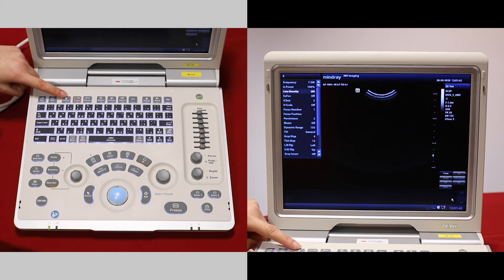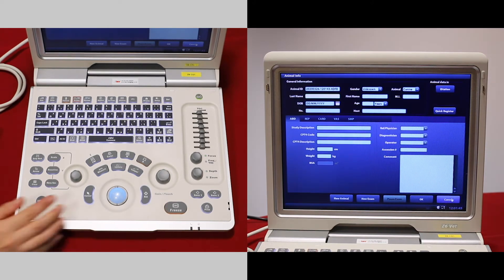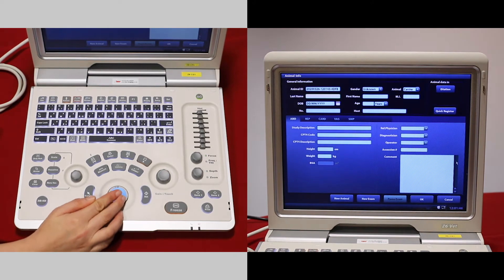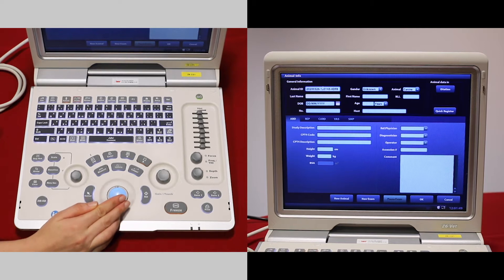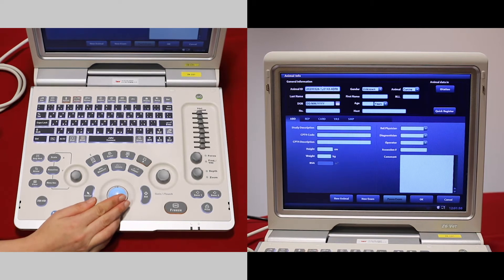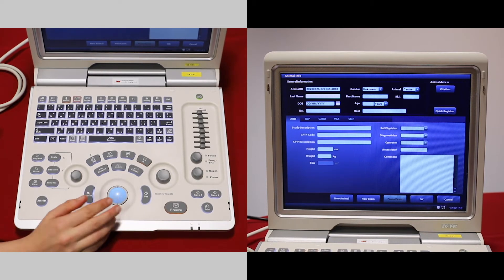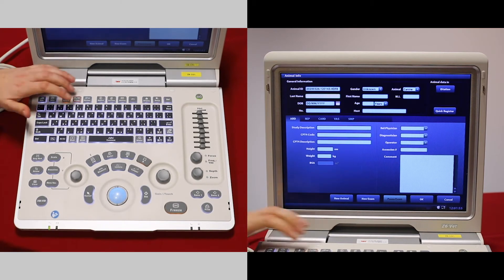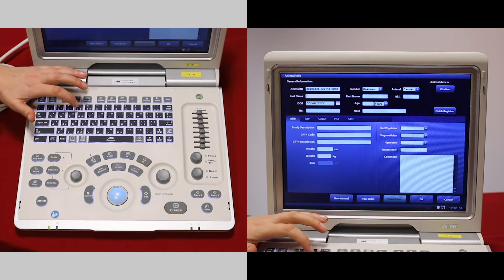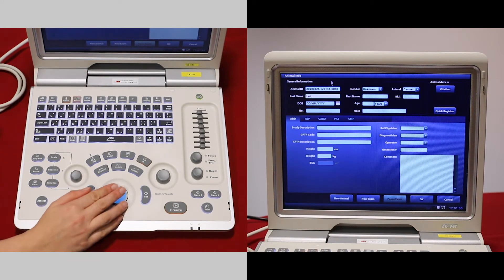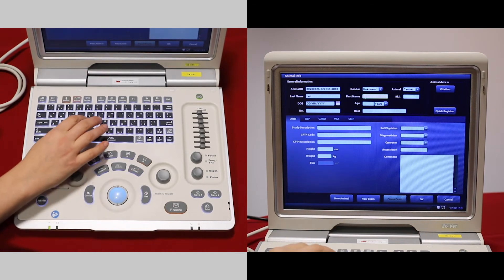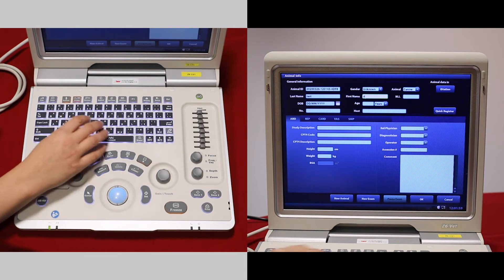The patient button is at the top here. We must input an ID number which is generated for you, but you can delete that and put your own one in. We also must put in a last name — usually the client name — and a first name — usually the animal name.